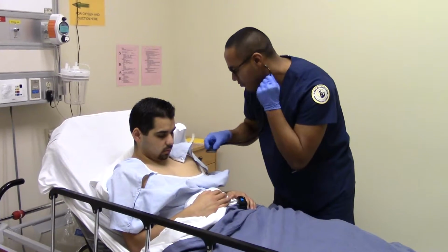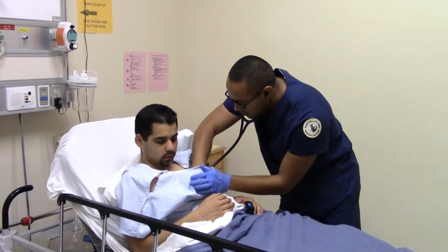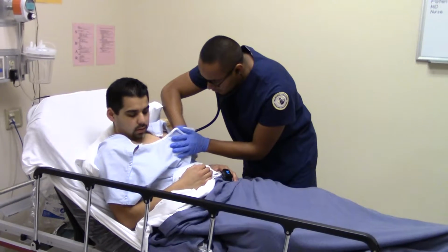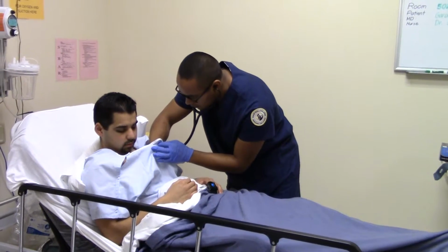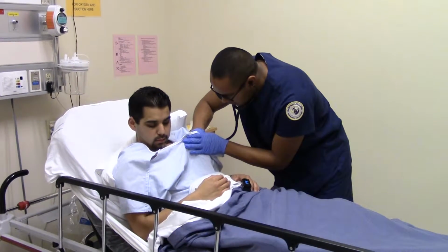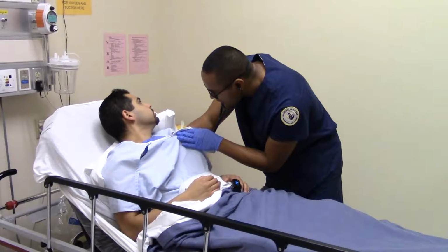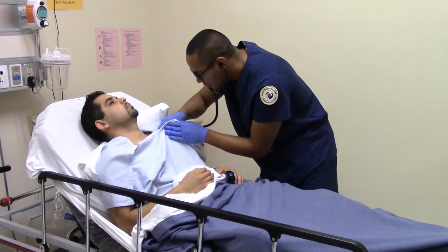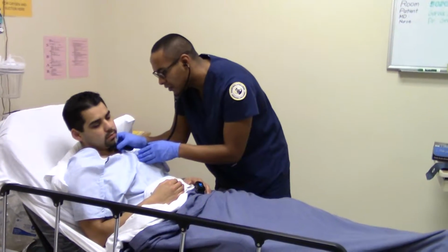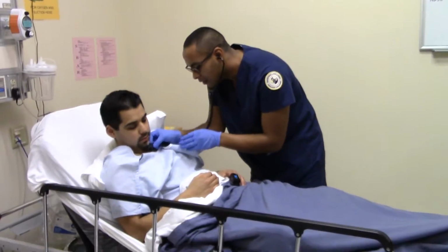Alright. Go ahead and breathe in. And out. Breathe in. Breathe through your mouth. Through your mouth. Okay.